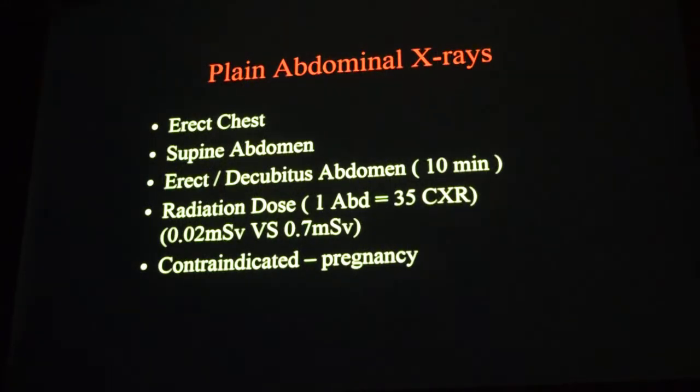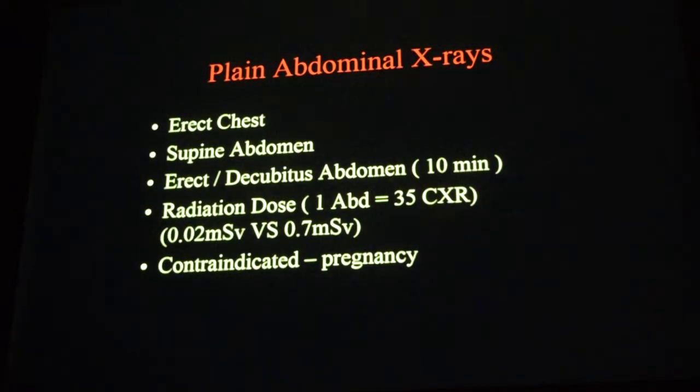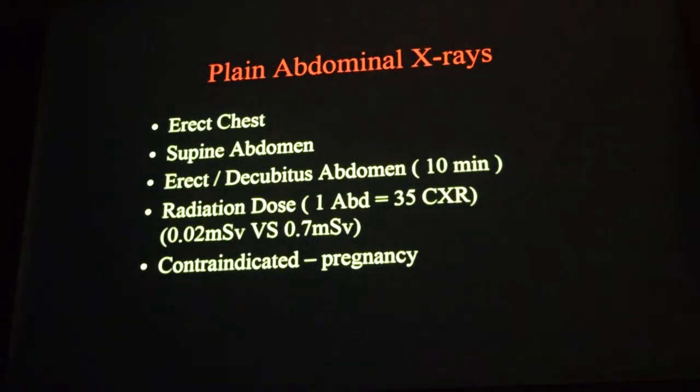In the chest, we already have a lot of contrast. If you look at the chest, the majority of it is occupied by the lungs, which is air. It's not soft tissue, it's just simple air. So there's already inherent contrast in the body. So when we do an X-ray for the chest, we use a high kV technique. The kV we give, kVp, if you go home and Google it, you'll see that the kV we give in chest X-rays is high. High kV means more X-rays penetrate easily instead of being absorbed.